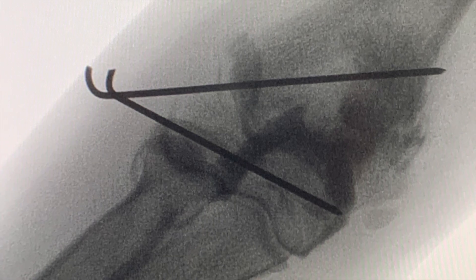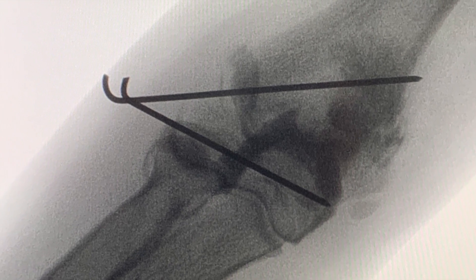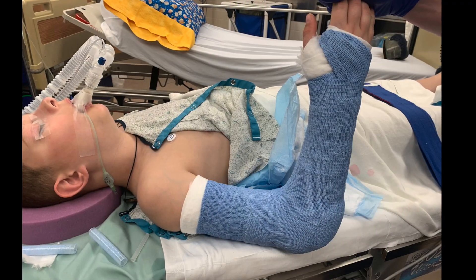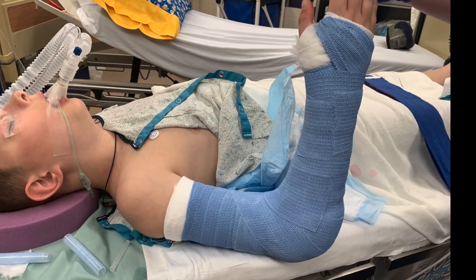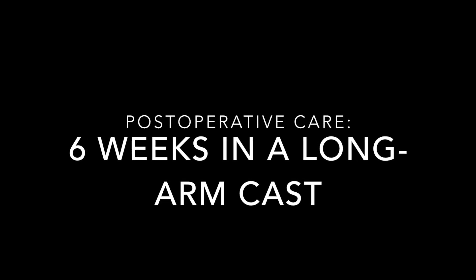A final arthrogram confirms reduction and pin placement. The patient is then placed into a long arm cast. Once the cast is removed, the pins are pulled and the patient begins a rehabilitation program.